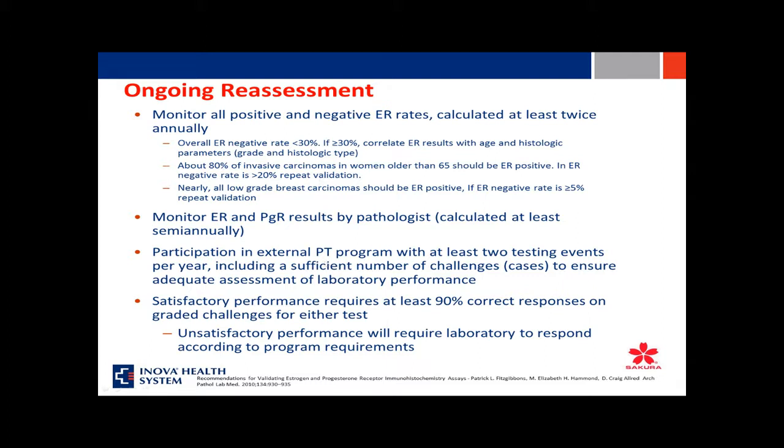And the pathologist must also be skill tested semi-annually. The pathologists who did not participate in the initial validation, they have to take the skill validation on at least 20 positives and 20 negative specimens. And I think the requirements are they should be 95% correct. So out of 40 specimens, they can only grade less than 2 incorrect assessments.